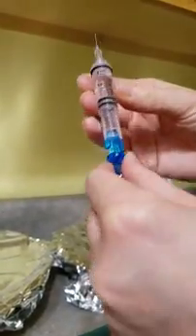We have to pull it really gently. I'm going to pull it down here. And then you got to make sure there's no bubbles. I usually squirt some out the top of the needle. Tap it. Make sure there's no air bubbles in there.